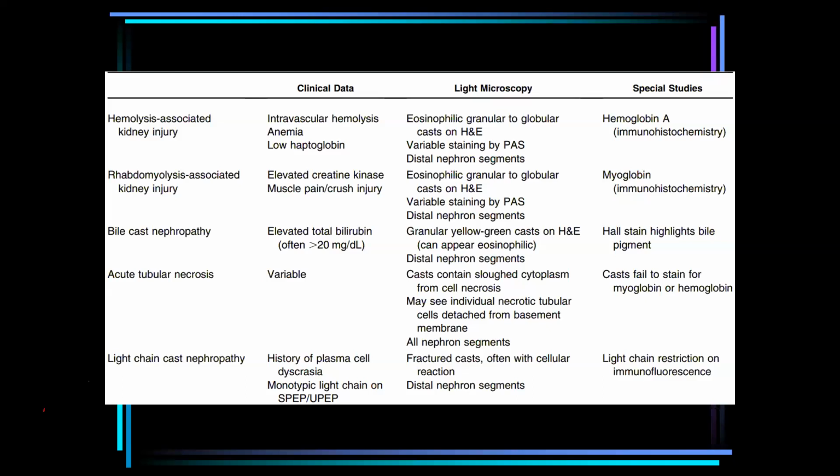My job now is to tell what is meant in pathological terms about the different casts that may develop inside the lumen of the renal tubule, which in the majority of cases are associated with AKI, what the clinical scenario is in which these casts may develop, and how to differentiate.